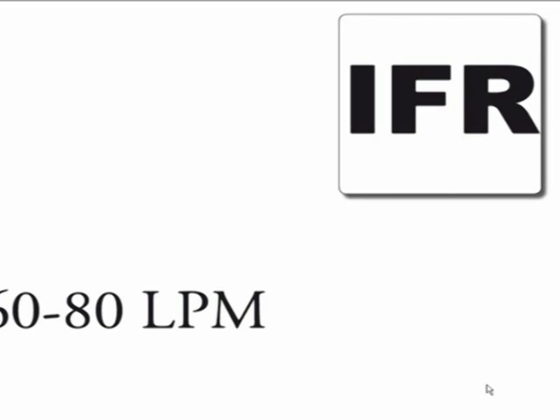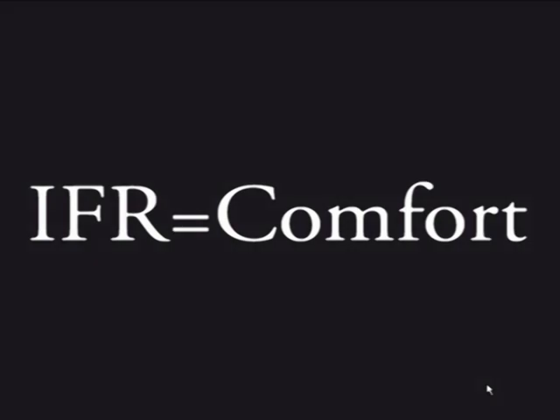But like I said, if you have a patient that looks uncomfortable, they look like they are not getting enough air at the beginning of each breath, then you just raise it up. And you can't do too much wrong with this dial. You go wherever you need to go. And when we get to the obstructive path, we'll tell you why you might want to increase it for those patients. So we said tidal volume equals protection, and by that same trend, inspiratory flow rate equals comfort. That's when you're going to change this setting. If the patient doesn't look comfortable on the vent, you're going to increase the inspiratory flow rate.